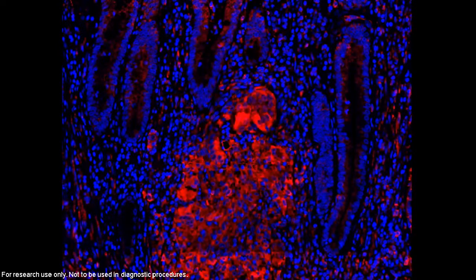Now we're interested in our target of interest. Our target of interest is shown in red. And you can see that the context of expression here is very focalized to that pathological feature of disease, that crypt abscess in the epithelial cells and the cells beneath that abscess. But now we have some additional questions. What kind of cells are these? What state are they in? And why are they different than the cells in the surrounding tissue?